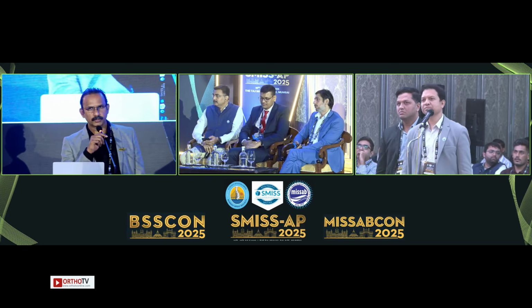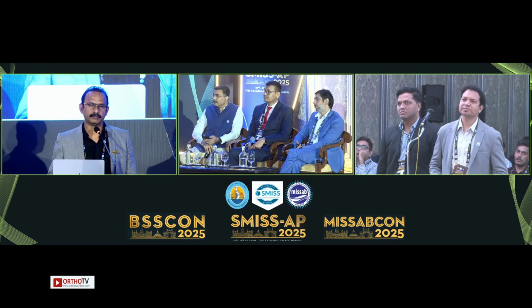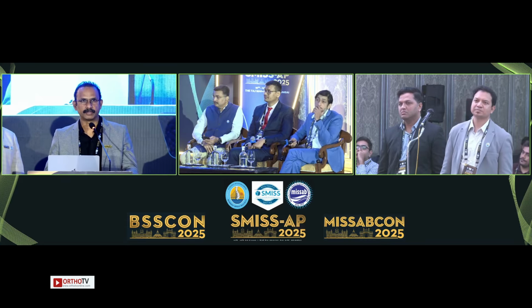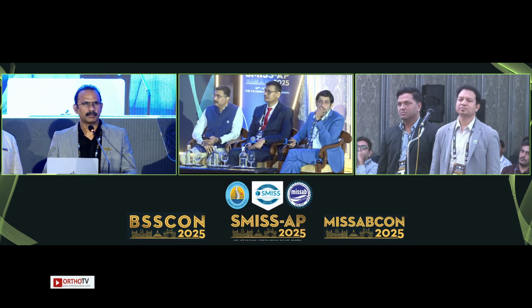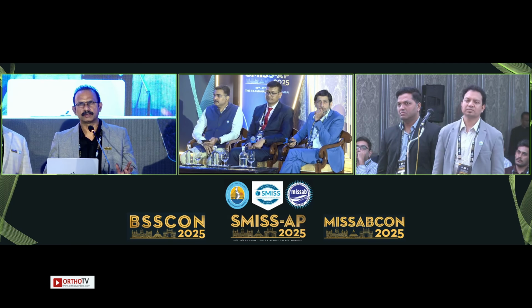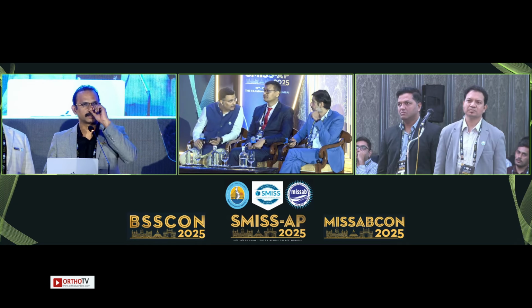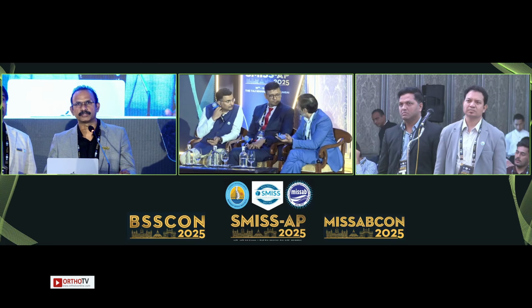Yeah, I think that's a good question. That will go with your experience. Initially, as a learner, as a beginner, you will need more, because you need to be very precise with your needle and your instruments. So initially, you might take a few more shots, but over a period of time, it's a matter of your experience. You are improving your skill set, and you will need far fewer. Once your needle is inside and your scope, your cannula is inside, after that I think you don't need any shots at all.